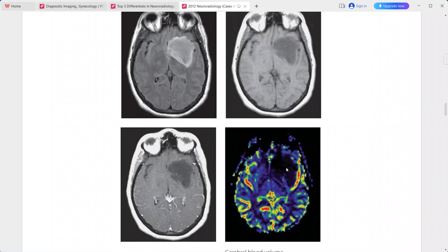This is the typical imaging picture of low-grade fibrillary astrocytoma. In the differentials, you can include anaplastic astrocytoma, oligodendroglioma, subacute infarction, and encephalitis.